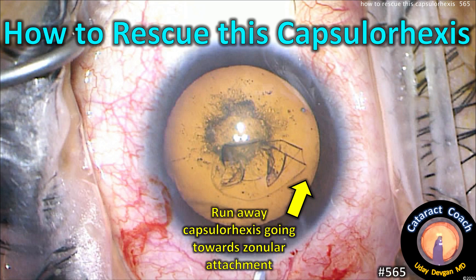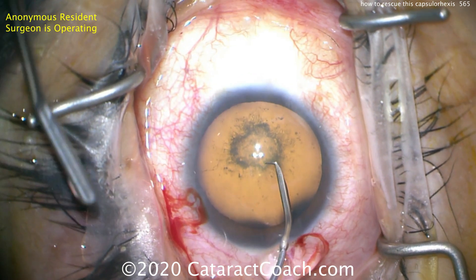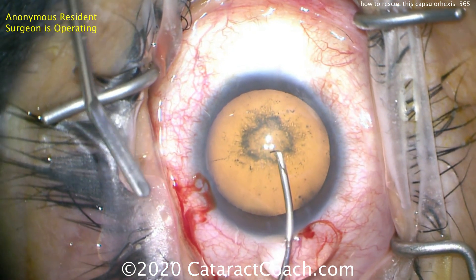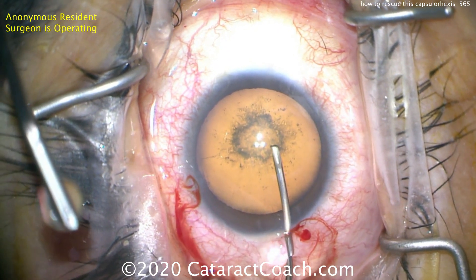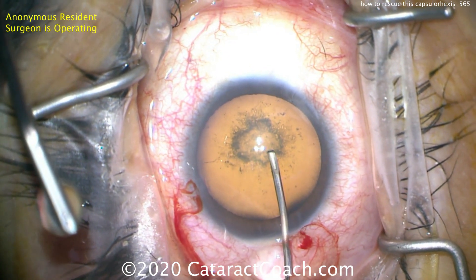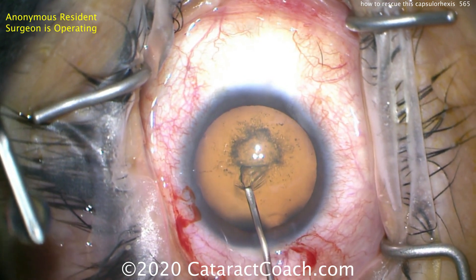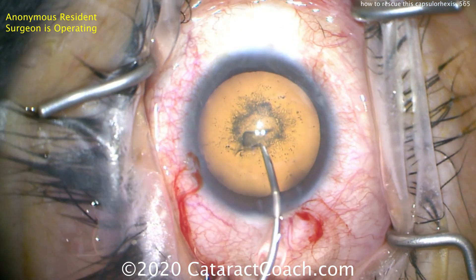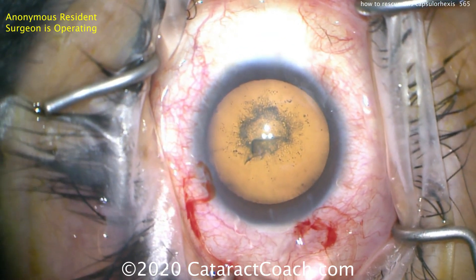CataractCoach.com — how to rescue a capsulorrhexis that's run away and going towards zonular attachment. Here's the case: starting off by making an entry point into the anterior lens capsule with the cystitome, poking in the center. The incision looks pretty good, good draping, nice dilation — looks like a posterior subcapsular cataract. Looks pretty routine, and there's a little opening with the cystitome.